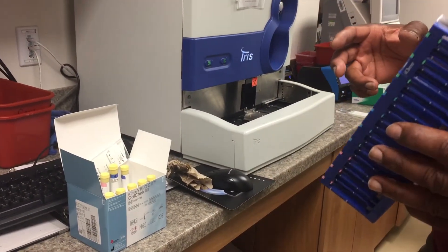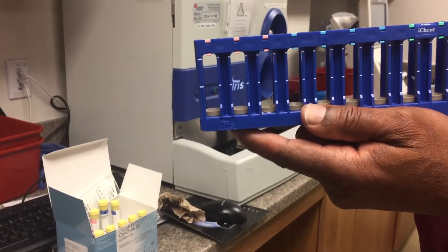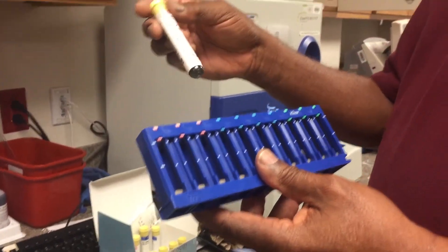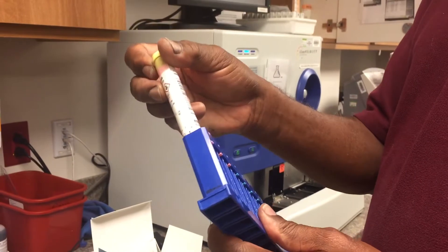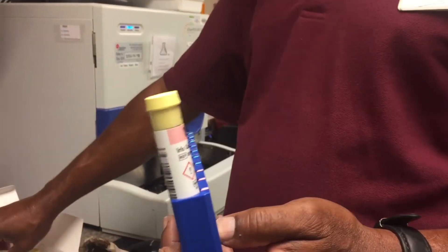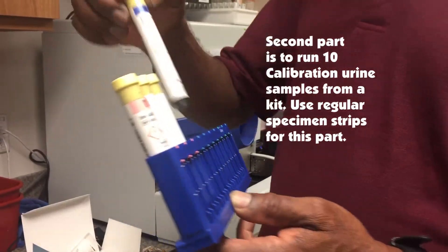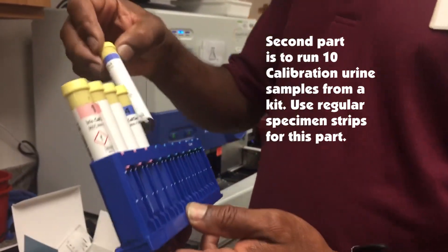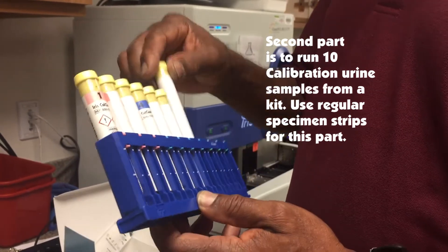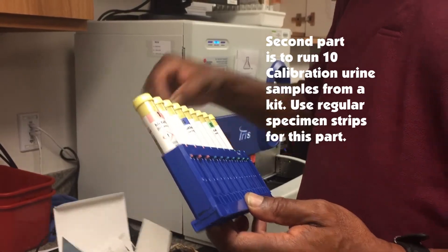Now we've got to run the liquid. This is the rack you use right here, and that was in the covering. The tubes are going to be labeled — tube one has a barcode, two has no barcode, three, four has a barcode, five, six, seven, eight has a barcode, nine, and ten. They've got to be in order.